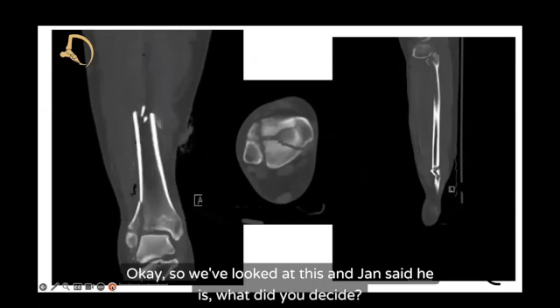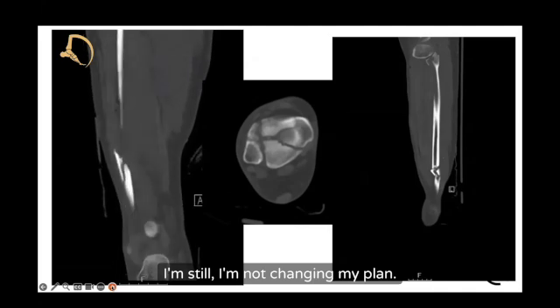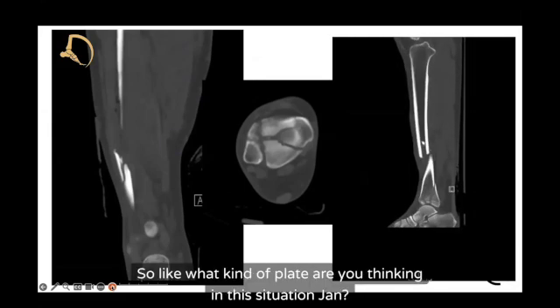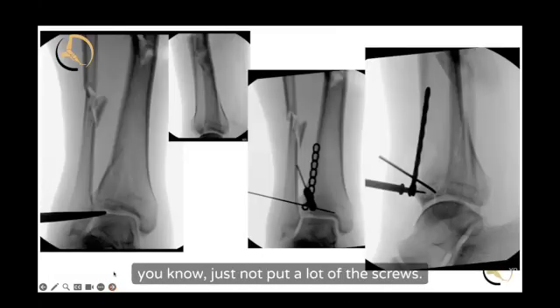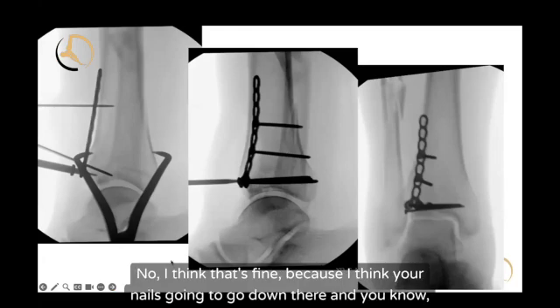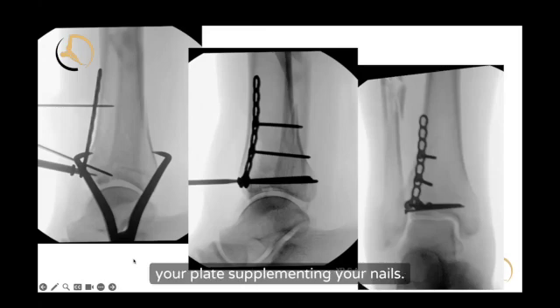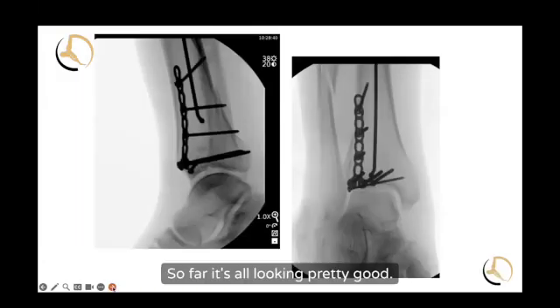Jan's not changing his plan. He would reduce the joint, plate it, and then nail the tibia. He's thinking an anterolateral plate, not putting in a lot of screws — maybe some mini-frag fixation, just depending on how it came together. The nail goes down there supplementing the plate, and the plate supplements the nail. You don't need a monster construct or a monster plate here. So far everything is looking pretty good.